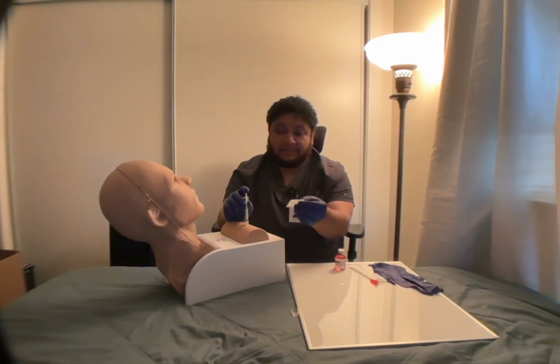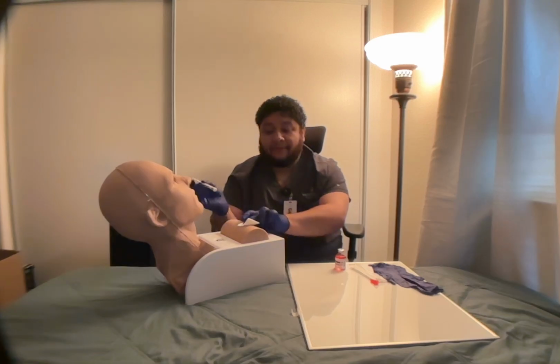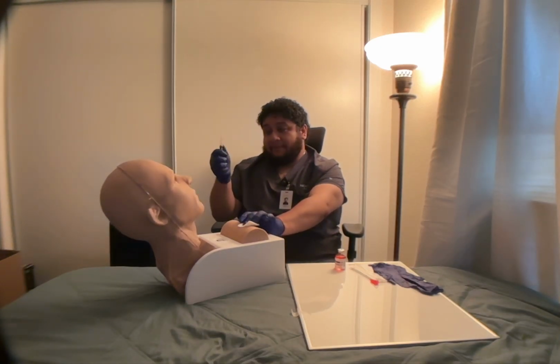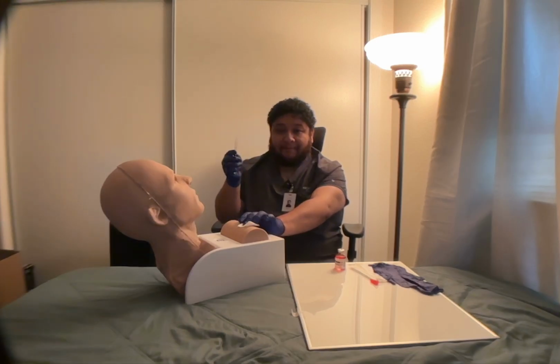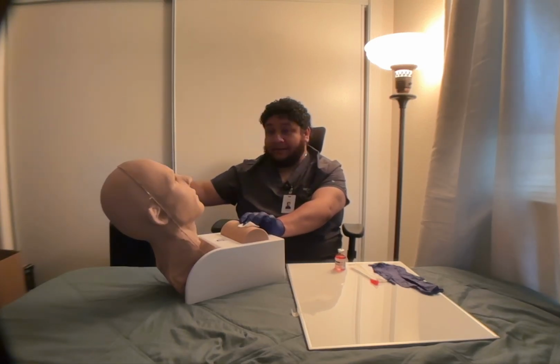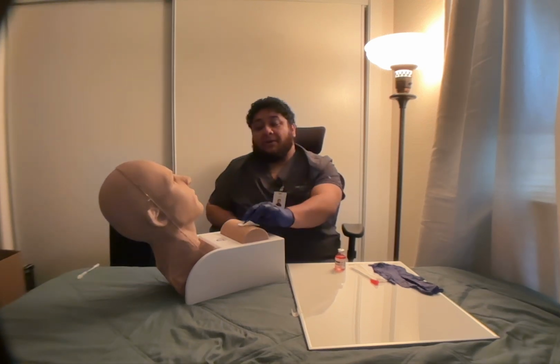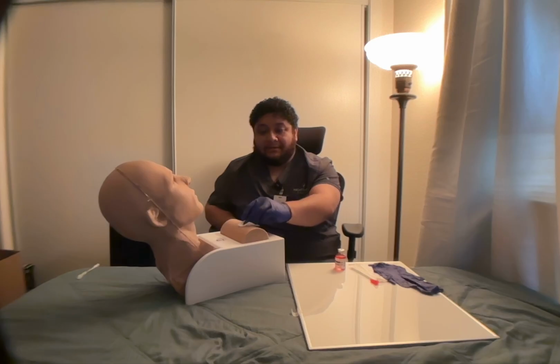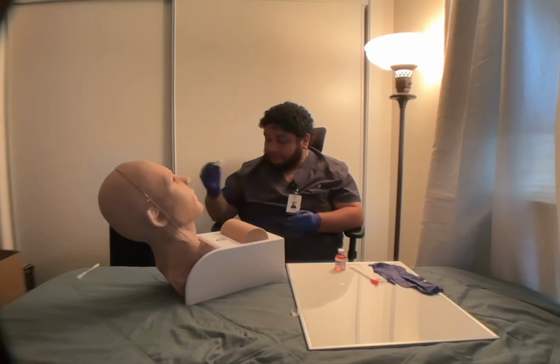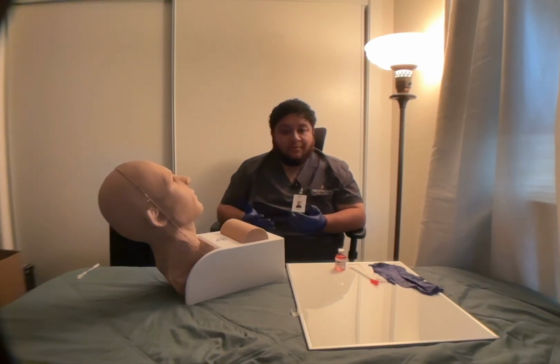I will take a gauze and gently remove the syringe and apply the gauze, and I will put the safety cap on the syringe, drop into the sharps container. I don't have a container with me here, so I'm just gonna place far away. Okay, you don't want to massage the area where the gauze is. You're gonna lift to see if there's any bleeding. There's no bleeding present, and then I'm just gonna go ahead and discard that. My patient needs no bandage, so there's no bleeding.